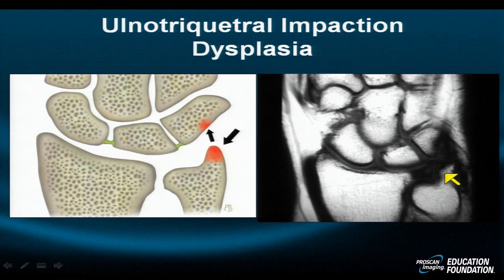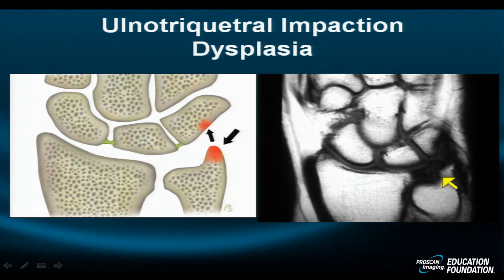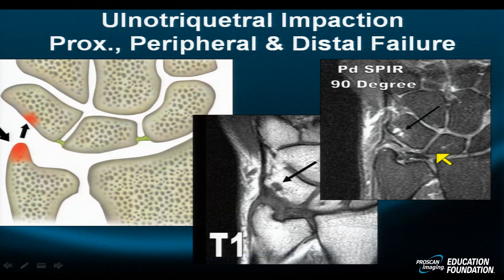In patients with negative ulnar variance, sometimes the ulnar styloid is bizarrely long, fat, overgrown, or dysplastic. It may not seem problematic in the neutral position, but imagine playing golf and going from pronation to supination or from radial to ulnar deviation — you're going to abut these two structures and create diffuse swelling distal to the ulnar styloid, as seen here.